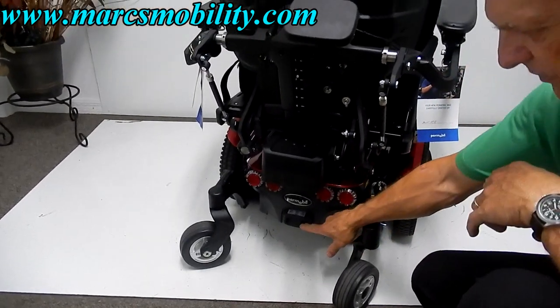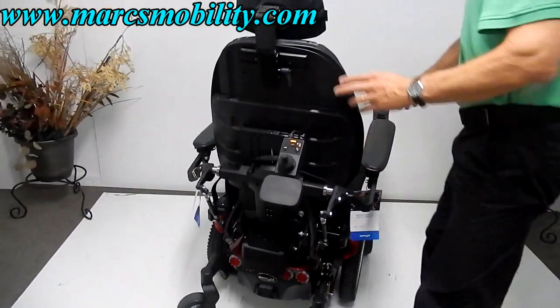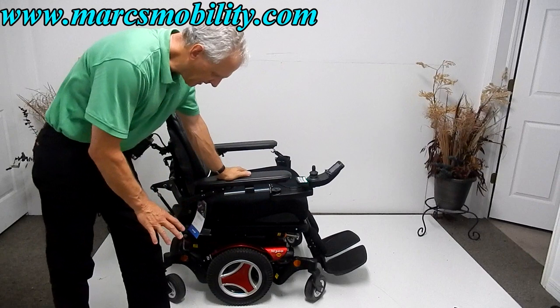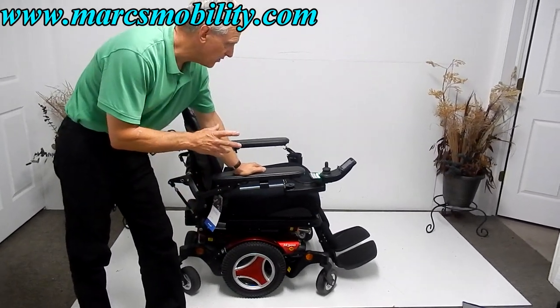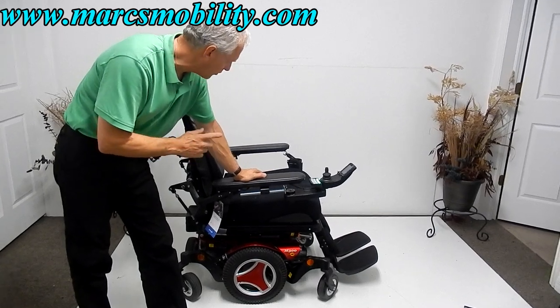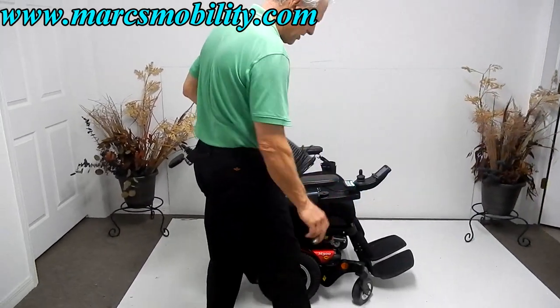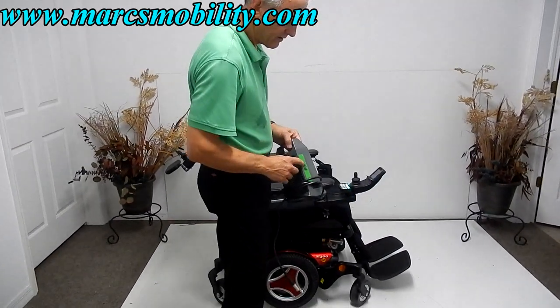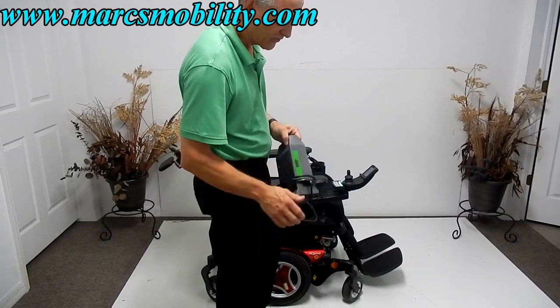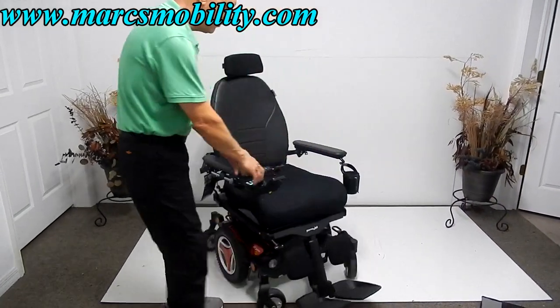These are reflectors in the back, not lights. There's a power button here that we always turn off when we ship one of these. This chair is heavy-duty, nearly brand new, and ready to go. For charging, like all Permobil chairs, you plug in the front of the joystick — when the light turns green on the charger the batteries are full. You don't have to worry about overcharging; once the charger recognizes the batteries are full it will stop automatically.